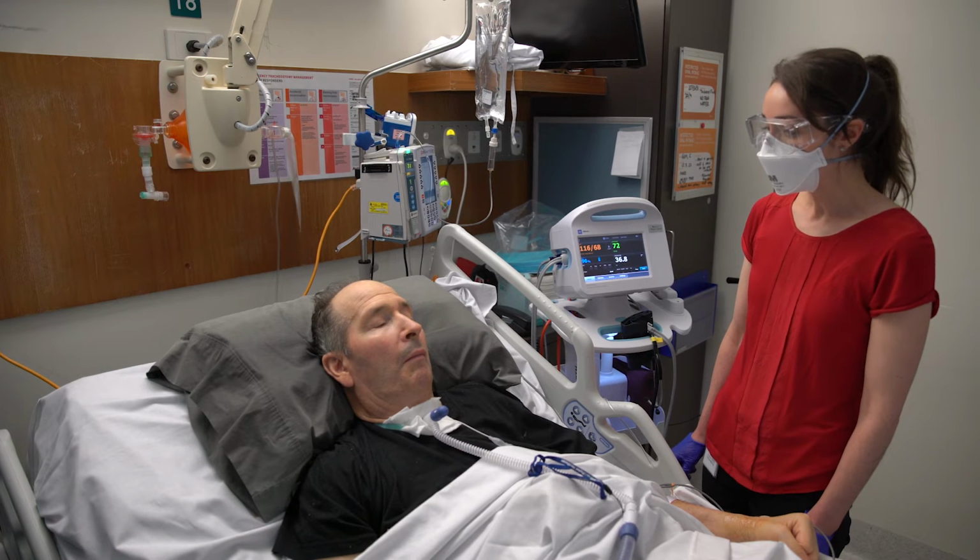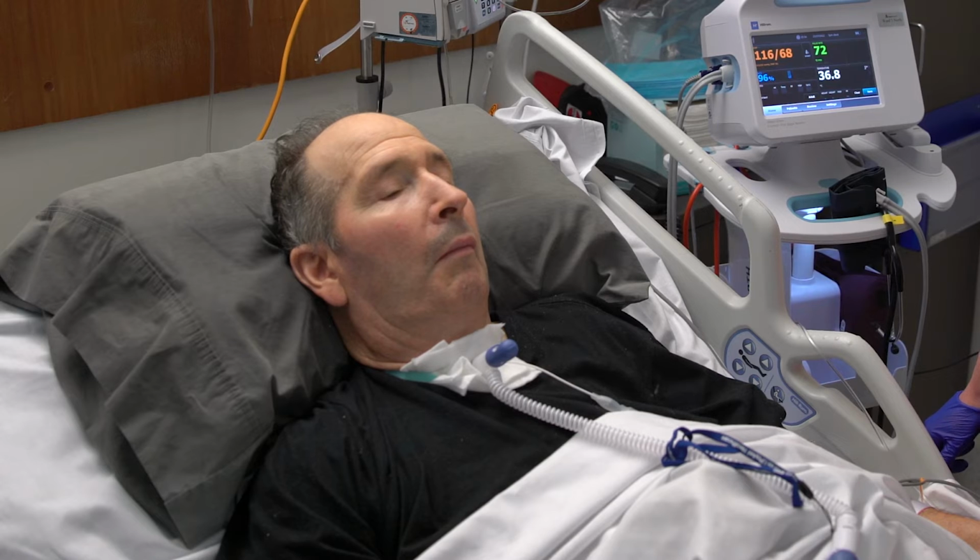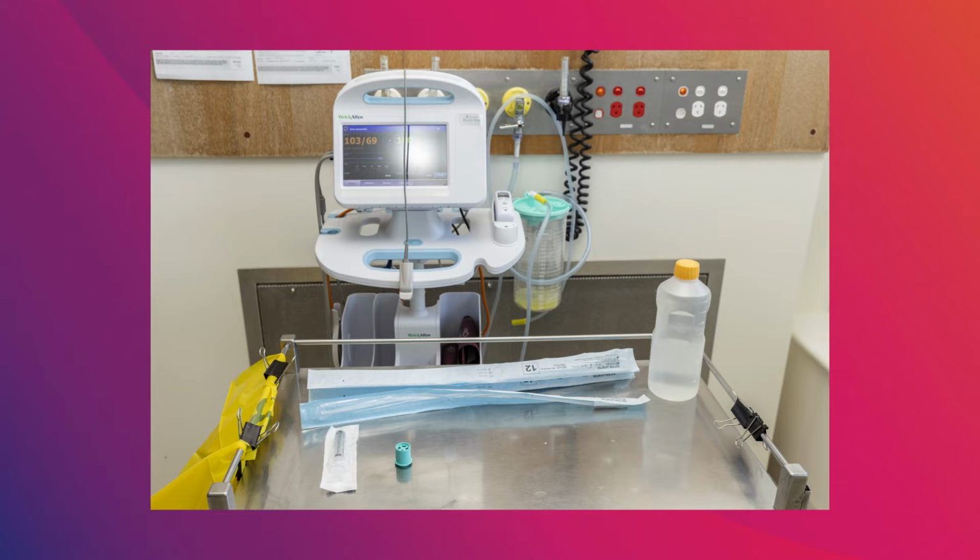Explain the procedure to the patient. Ensure that the patient is in a comfortable position. Prepare all necessary equipment. This should include routine tracheostomy PPE as per hospital policy, a 10ml syringe, functioning suctioning equipment, the Passy Muir valve, and pulse oximetry, used during initial sessions or if the patient's status changes.